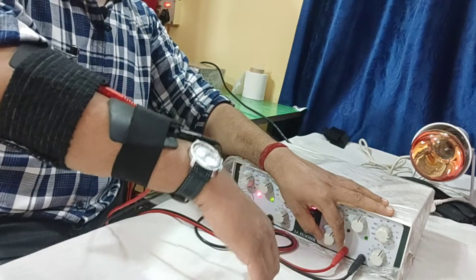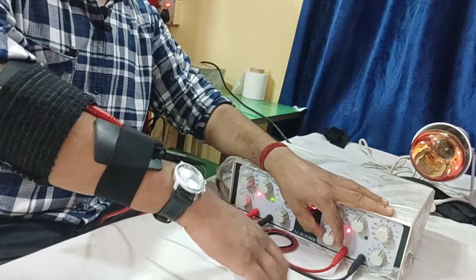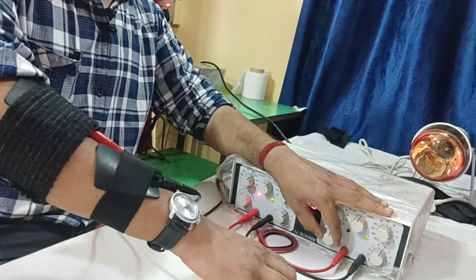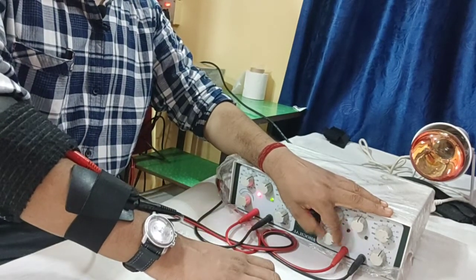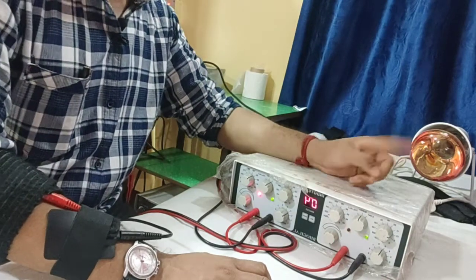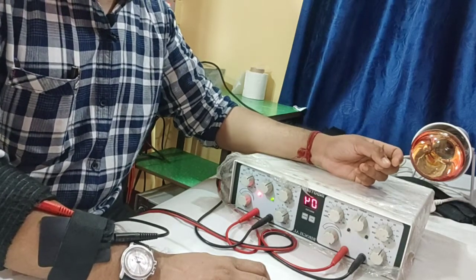This burst TENS works whenever a patient has a muscle spasm, or any type of whole muscle spasm, or any type of spasmodic pain of a particular group of muscles, or any taut band formation of a muscle. That is the time this burst TENS is used. To remember, the burst TENS you can only give within 15 minutes of duration. Conventional TENS is for only 20 minutes of duration. For the burst TENS, you need to go with 15 minutes of duration.